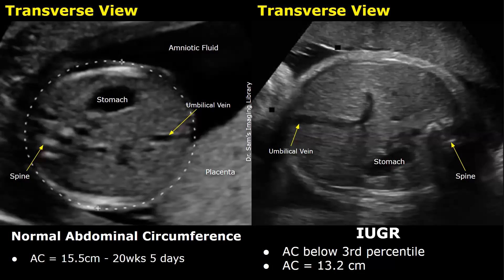Now we will compare features of a normal pregnancy with features of a growth-restricted fetus. In IUGR, the abdominal circumference is usually affected. On the left, we have a normal measurement of abdominal circumference corresponding to 20 weeks 5 days, and by LMP it was also 20 weeks. On the right, we have a small measurement of abdominal circumference — by LMP the gestational age was 20 weeks, but the AC measurement was 13.2 centimeters instead of the expected approximately 15.5 centimeters.